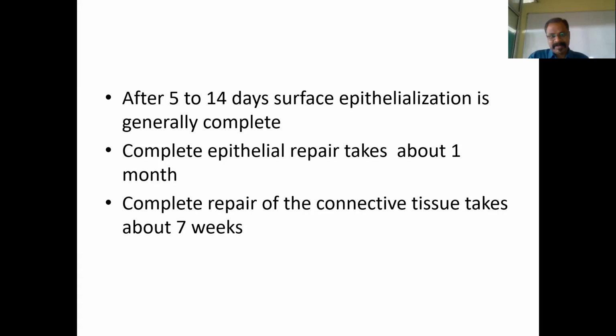Gingivectomy, as I said, is a surgical excision of the gingiva to remove the pocket wall. Gingivoplasty is the reshaping of your gingival contours. You can do it by a surgical method, an electrosurgical method, lasers, or a chemical method.